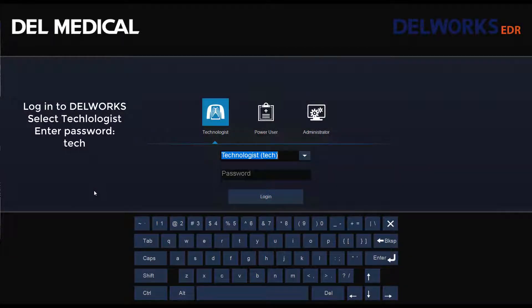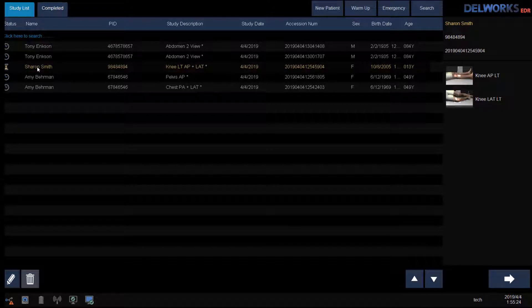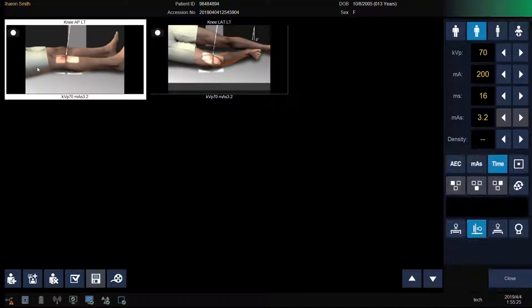First, log into Dellworks. Select Technologist and type in the password 'tech' lowercase. Select your patient by double-clicking on their name. Select the view you want to start with first.